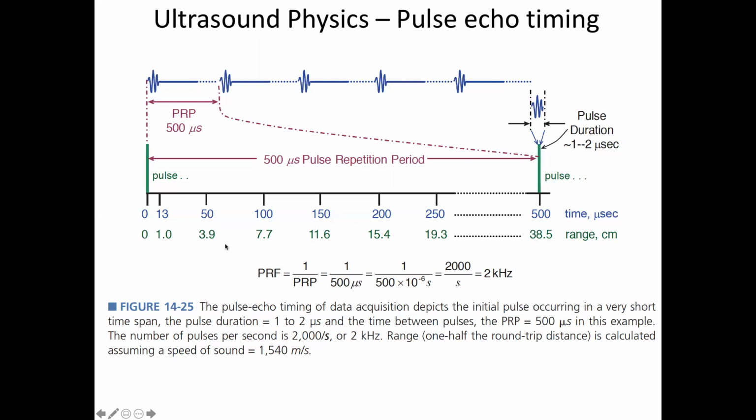And so time and depth, same thing, right, through this constant. So it's pretty easy to make one line of your two-dimensional picture, because you know where to put these things just by measuring the time that they came back. So you just plot them as dots, or bright spots, on your 2D picture, and then sweep through that and make a two-dimensional image.